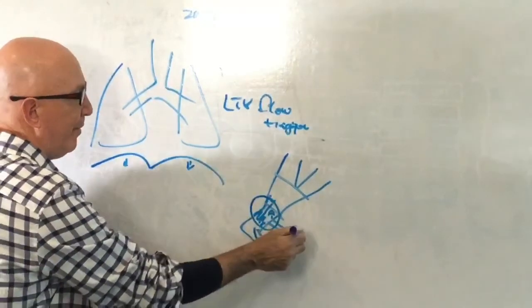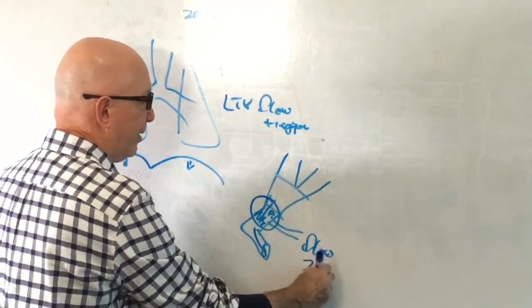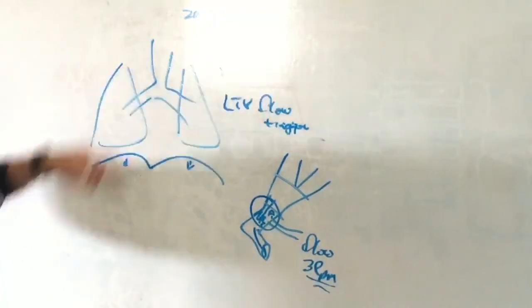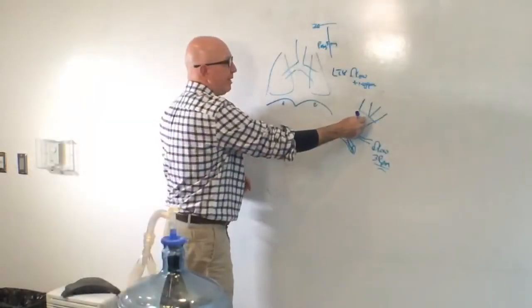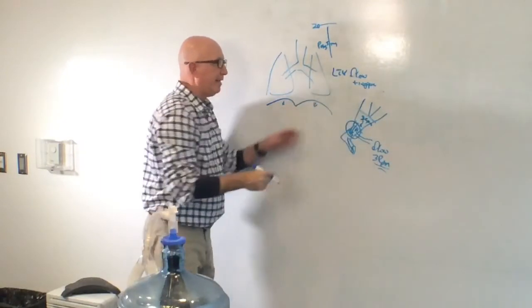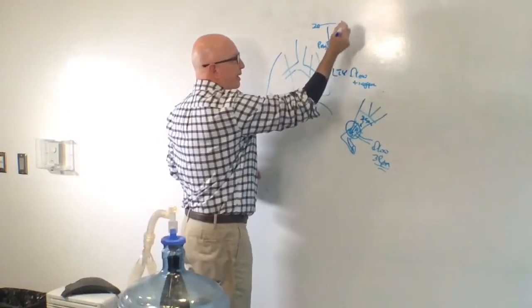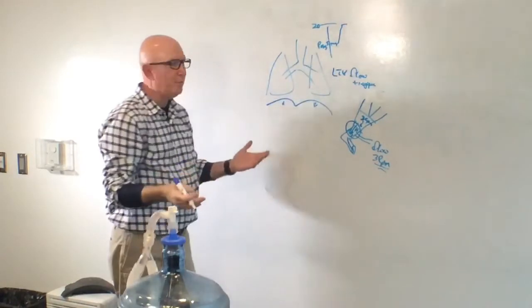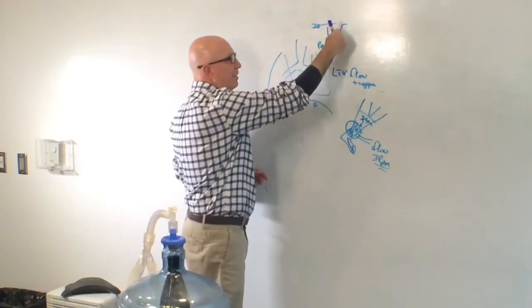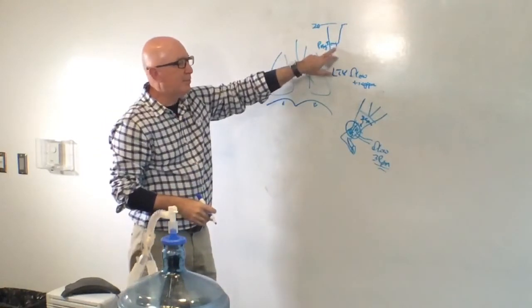And that pressure signal then is translated into flow, and the default in the adult mode on the ventilator is 3 liters per minute. So when the patient begins to inhale, there needs to be 3 liters per minute going past these 2 flow sensors, and at that point the machine recognizes inspiration and it kicks into a breath. So if they're in assist control, it'll be an assist control breath. If they're in pressure support ventilation, it'll be a PSV breath. But regardless of what it is, whether it's a volume or controlled breath, that's how the breath gets triggered.